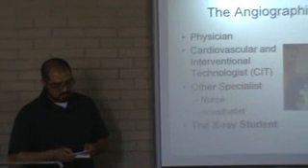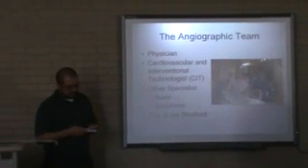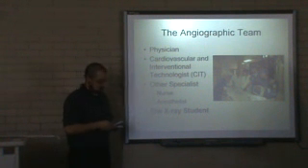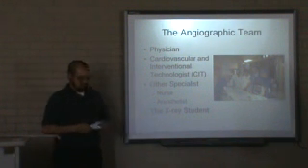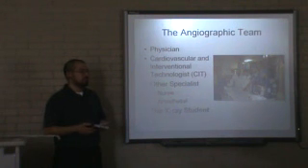The angiographic team that would be performing this procedure would be a physician, usually an interventional radiologist, a cardiovascular interventional technologist, other specialists like a nurse, and also the x-ray student, because you can be in the lab also, helping with the procedure.